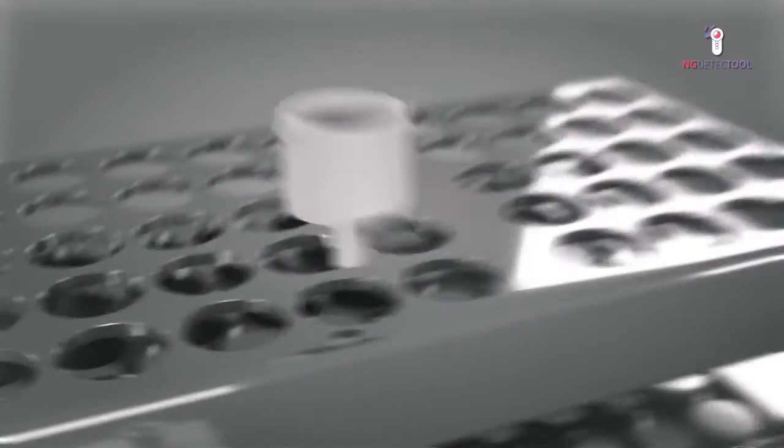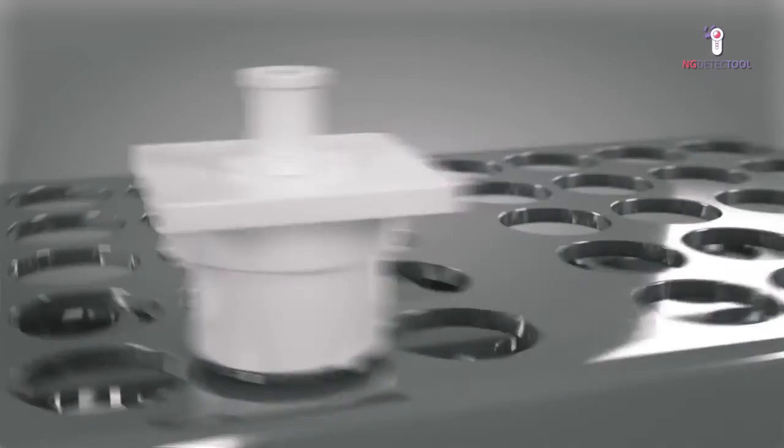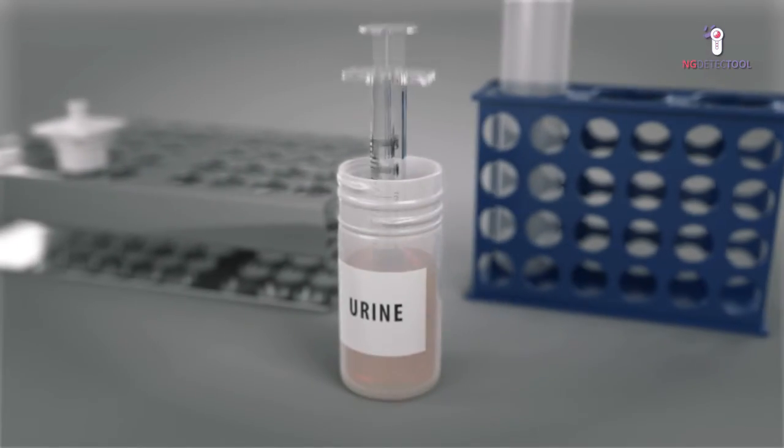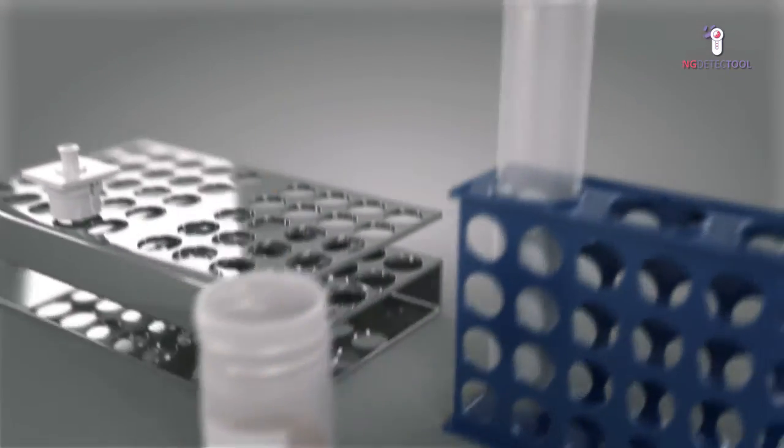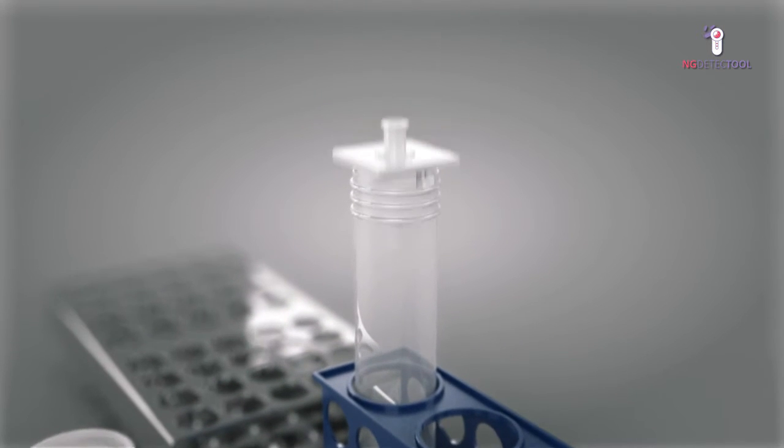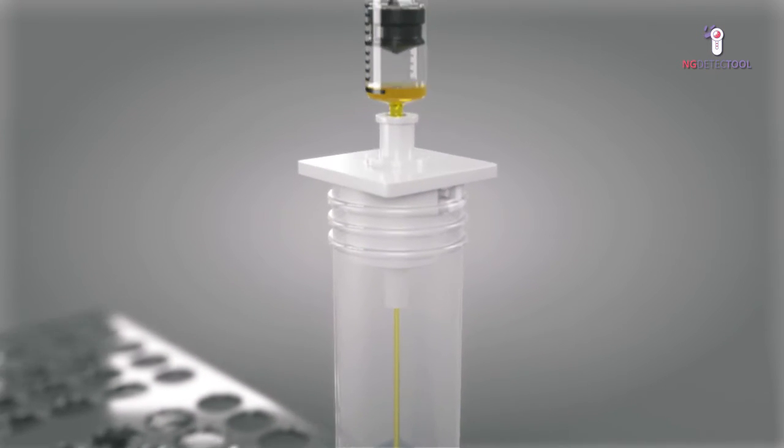In this case, insert the cup into the lower part of the device and close the filtration system with the upper part. Aspirate 5 milliliters of the liquid and some air using a syringe and push the sample through the filter until bubbles appear.